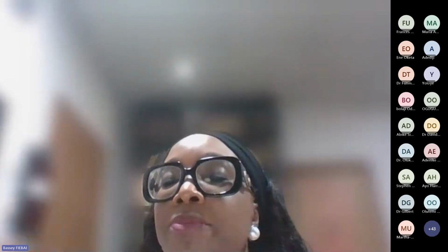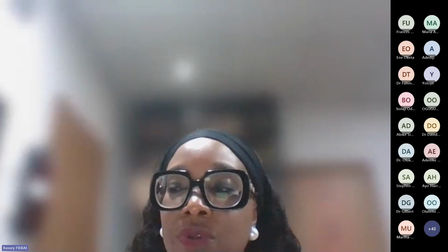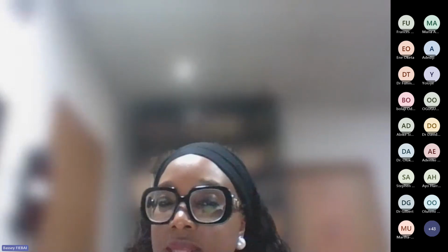While the axial, you center it on the cornea. The patient is looking in the primary position of gaze. So you put it over the closed eyelid, but you're putting it directly in front of the patient. You're not bypassing the lens. I don't know if you understand that.